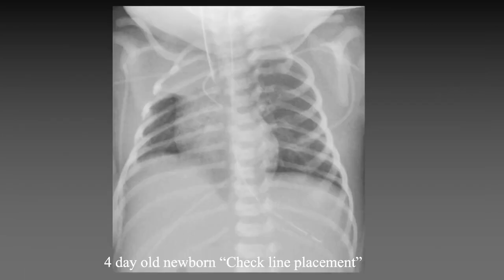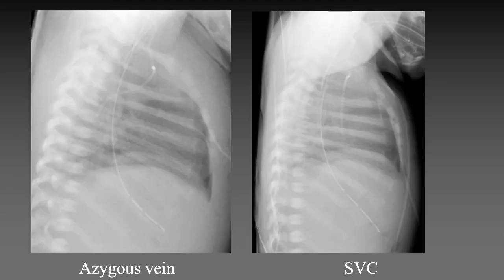Here is a newborn with a central venous catheter that takes an unusual course. In this situation, it is often helpful to obtain a lateral view of the chest. The tip of this catheter was in the azygous vein, located in a more posterior position than the normal superior vena cava.